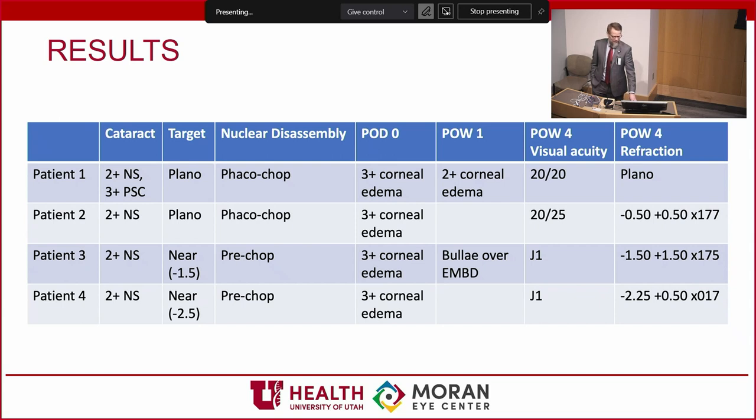Yeah, and the question then, it's interesting, we have proposed a couple of studies to them. There's not a lot of funding for a larger rabbit study, and that really becomes the issue. And yet, this is due to go to commercialization right around the time of ASCRS. This phenomenon hasn't been reported. As we've gone on with faster times, interestingly, again, there's no machine where you're seeing a readout at the end.